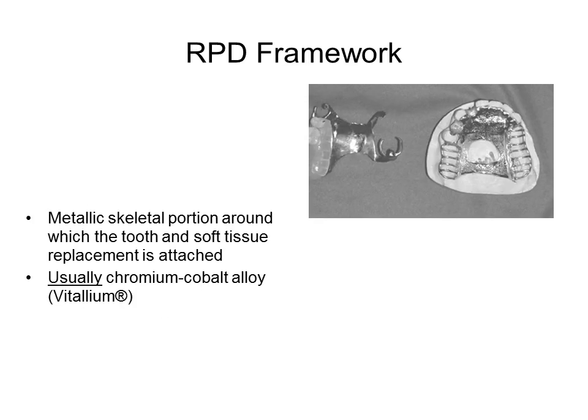The partial denture framework is the cast metallic supporting foundation for the removable partial denture. The framework may be cast from a variety of metals, but the chrome cobalt alloy Vitallium is the material from which our frameworks are made.